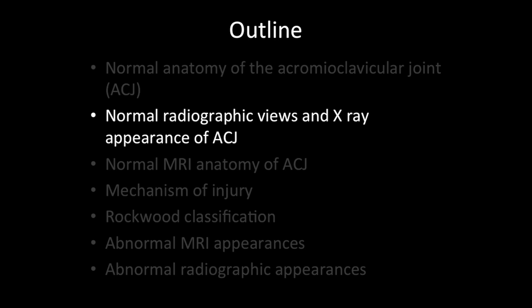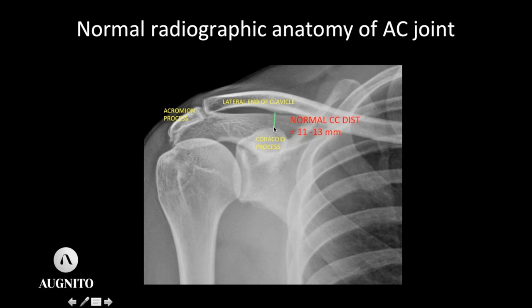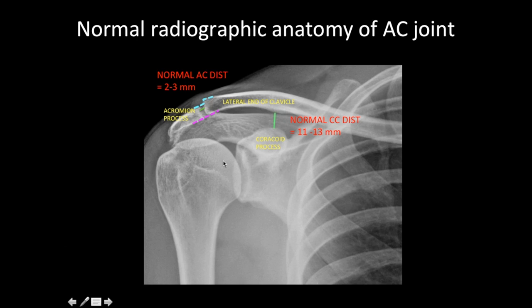This is the normal AP radiograph of the AC joint, showing the lateral end of the clavicle, the spine of the scapula forming the acromion process, the AC joint, the humerus articulating with the glenoid, and the coracoid process just above the glenoid. The normal coracoclavicular distance is about 11 to 13 millimeters, and the normal acromioclavicular joint space is about 2 to 3 millimeters. The inferior borders lie in the same plane, while the superior border may or may not align normally.